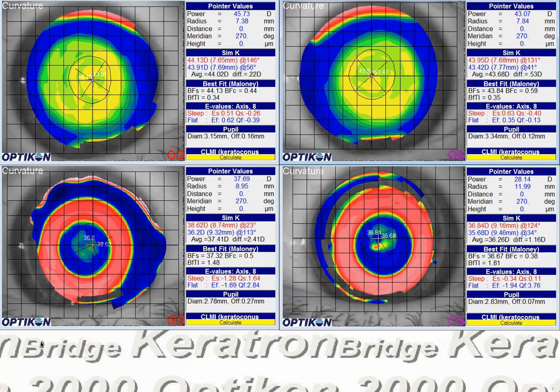This is an orthokeratology case where the patient is a higher myope, around 7 to 8 diopters, and was fitted with corneal scleral lenses. The lenses are decentering down and out in both eyes, and the patient is getting some hazy, fluctuating vision. If we look at the baseline anatomy, we can see that the corneas themselves are decentered, and so that's going to shift the lenses, and we can't do too much about what the anatomy dictates.